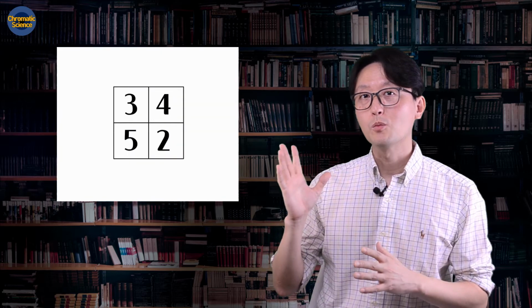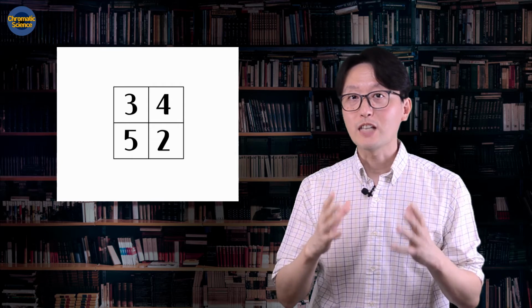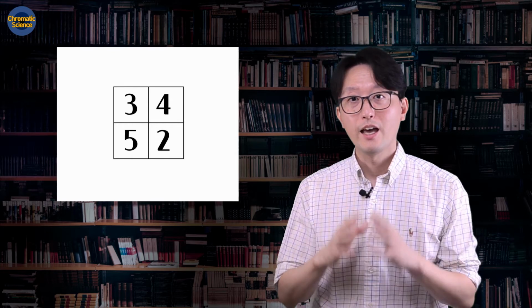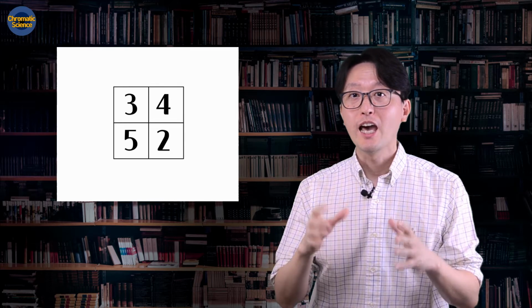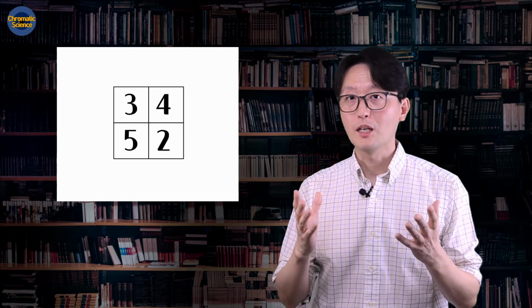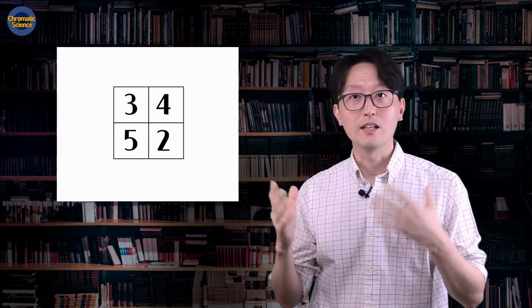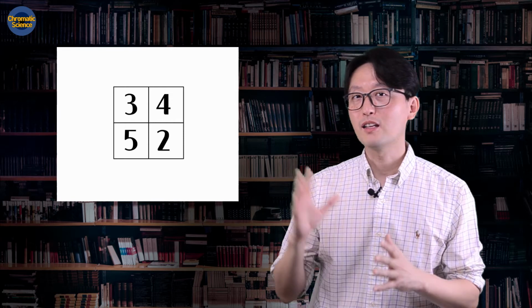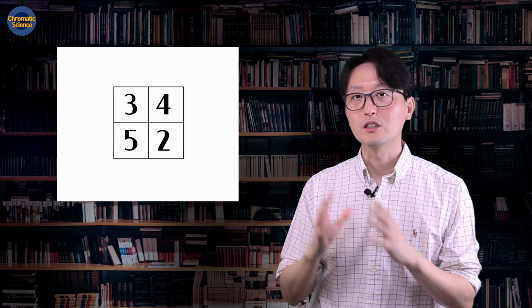Now let's connect the data collection in CT equipment and the mathematical problem that I gave you. Okay, let's assume that these 4 numbers are representing the cross-section images of the body, and each number represents the amount of reduction in X-ray intensity. For example, number 5 represents bones, number 2 represents fat. Actually, I talked about these numbers in the previous clip. These numbers are called attenuation coefficients.